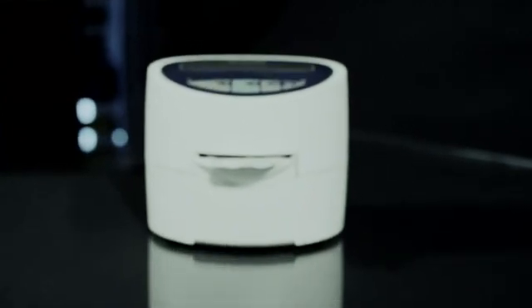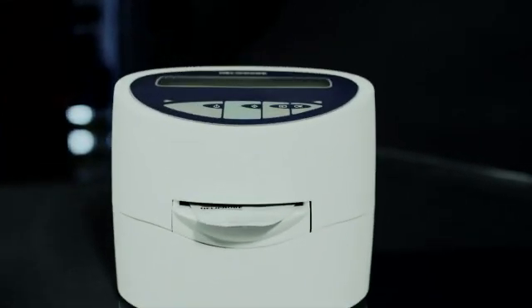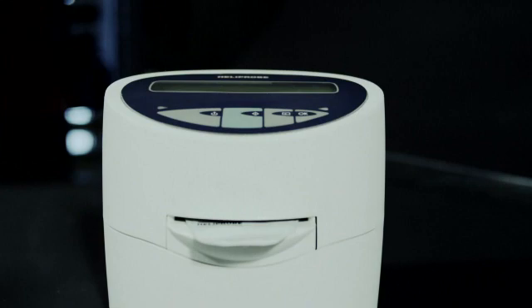The Heliprobe system from Kibion offers fast and reliable diagnosis of Helicobacter pylori. It's suitable for test and treat, and follow-up after treatment.